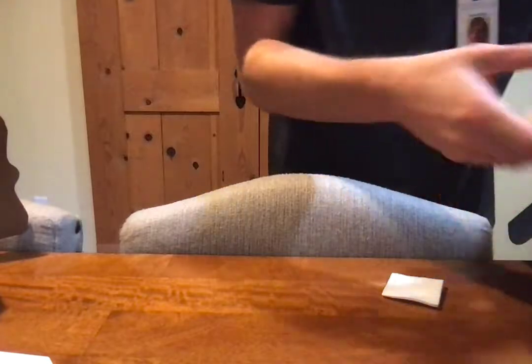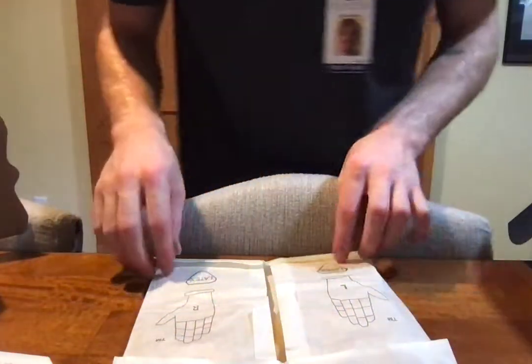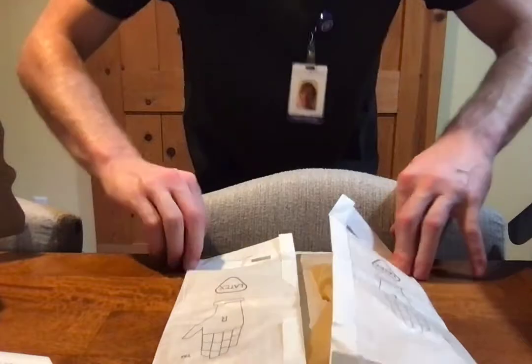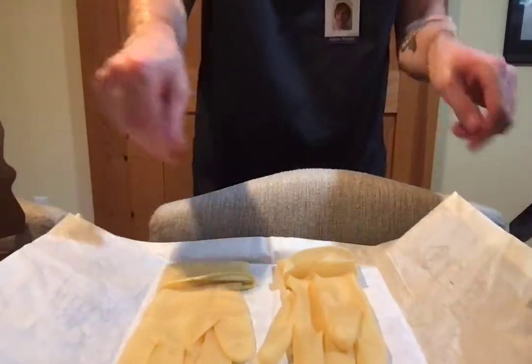And then I would be putting on some sterile gloves. I had some other sterile gloves because I was afraid that the ones that were provided would not fit. So here we are, hopefully with some ones that will fit me a little bit better.